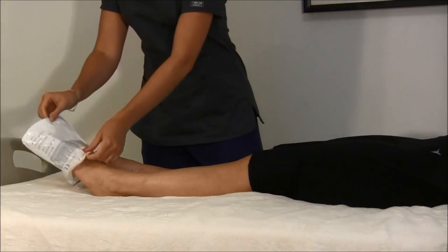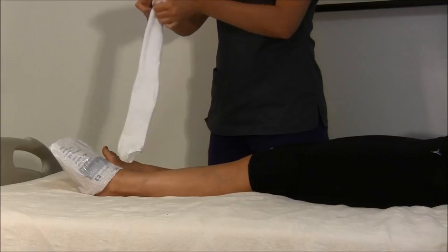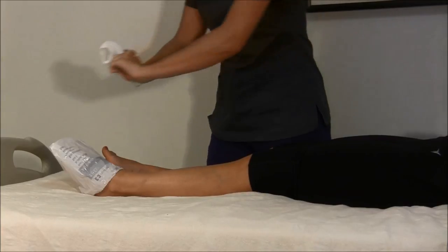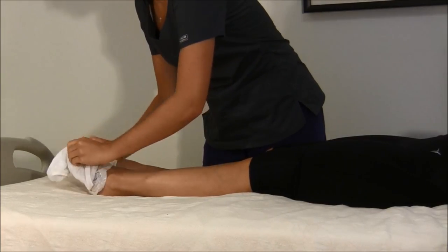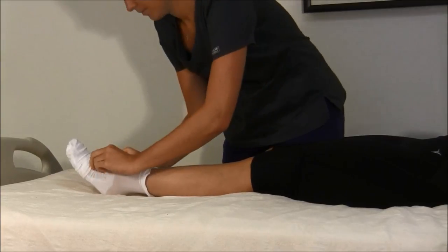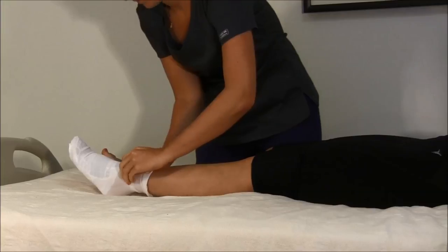First, place the plastic bag over the foot. Gather the stockings in your hands and position the stocking over the foot, making sure that the hole is over the toes and the heel is in the pocket. Slip the body of the stocking over the plastic bag. Slide the body of the stocking over the leg, inching it up the leg until smooth.